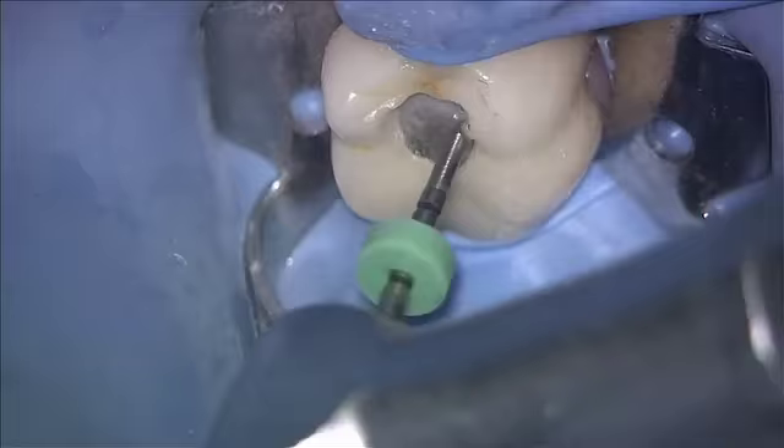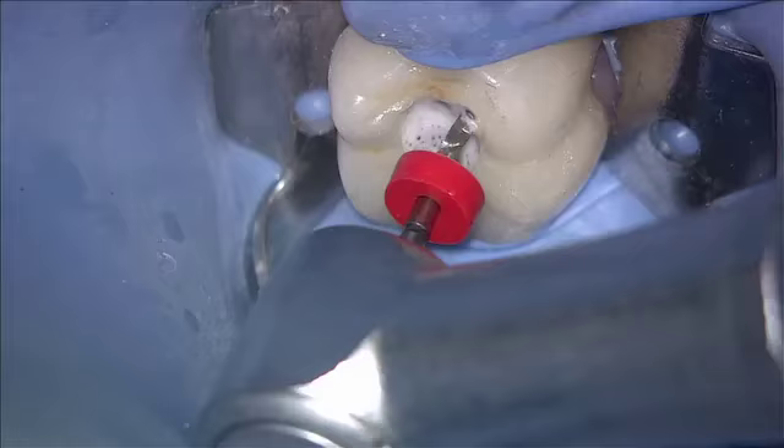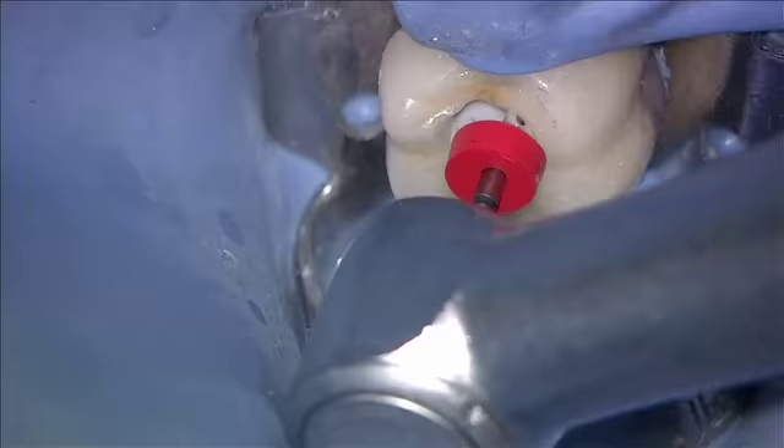I haven't used 8s, 10s, or 15s. The 1506 Vortex File behaves in a truly amazing way. I've found that they will cut to length as the first negotiating file in probably 70% of the cases. In the rest, I bring in an 08K file. If I can't get to length with the Vortex instruments, I bring in a K file and I'm there.